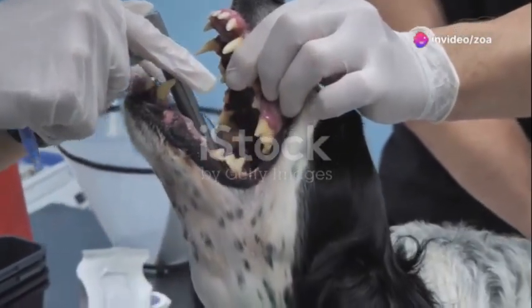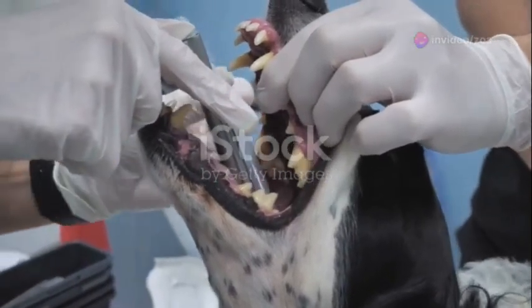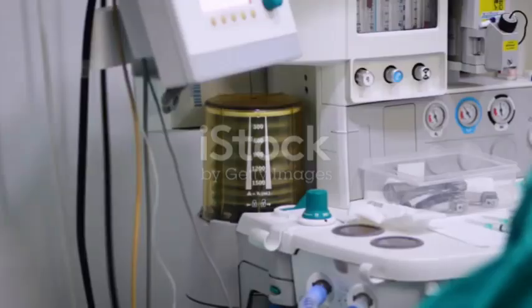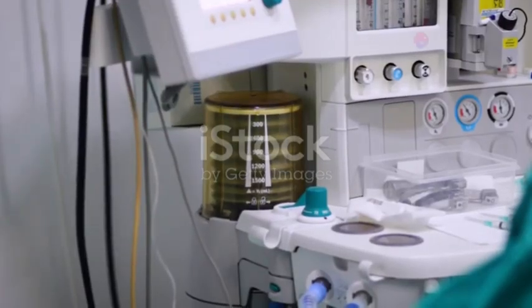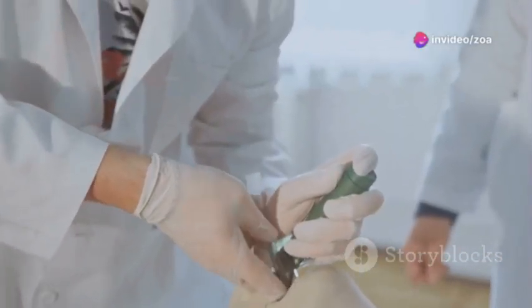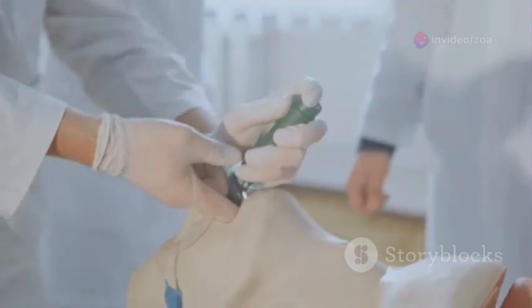Nasal intubation is a procedure where an endotracheal tube, or ETT, is inserted through the nose and advanced into the trachea. This secures the airway, allowing for mechanical ventilation. It is an alternative to oral intubation, offering advantages in specific clinical scenarios.